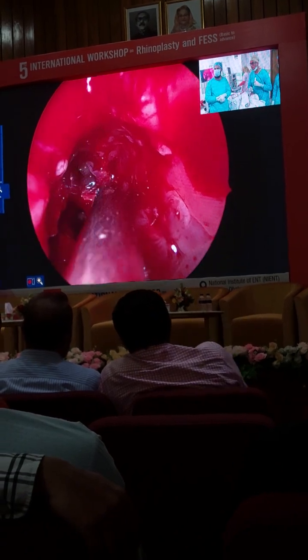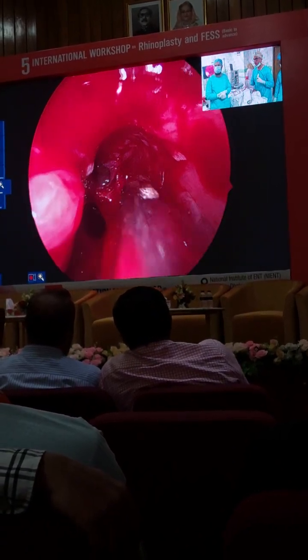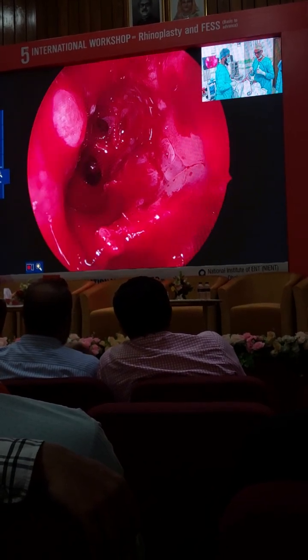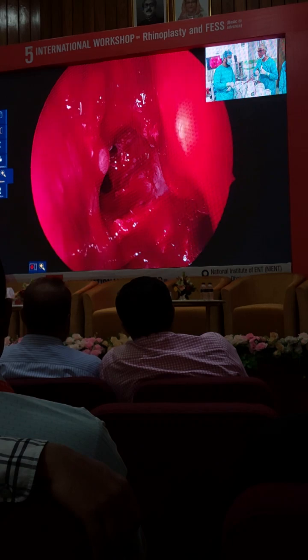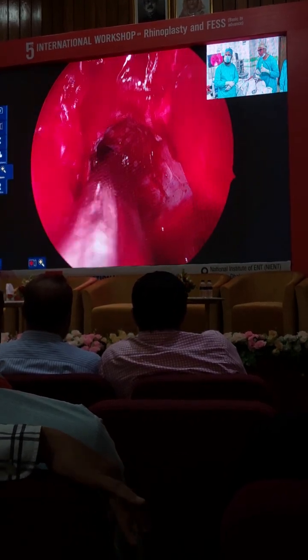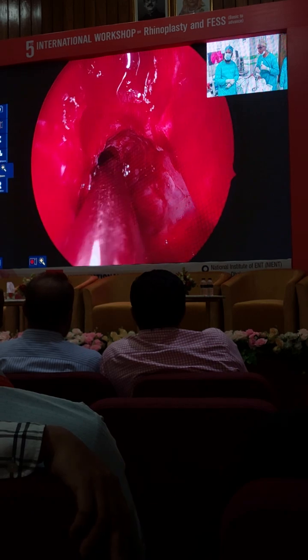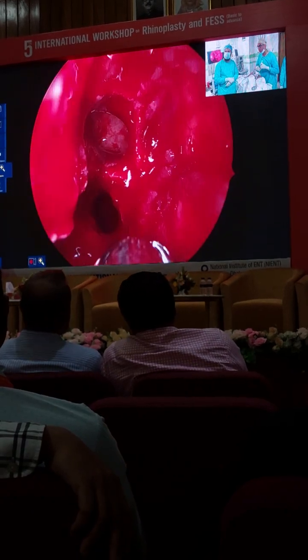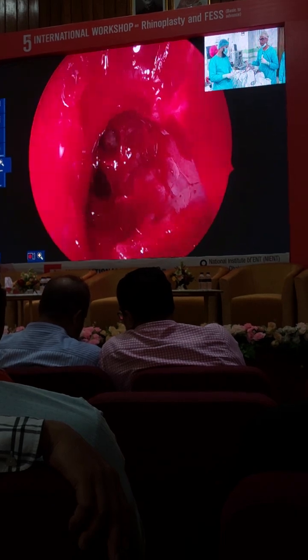Okay. Okay. Give me the divider. Now I know my optic is not related to that so much as it is to the ethmoid, to the sphenoid. So I can take a little bit, but of course I will still not point it laterally. I just want to see inside clearly. Okay? Very beautiful. Now from there we keep going superiorly.